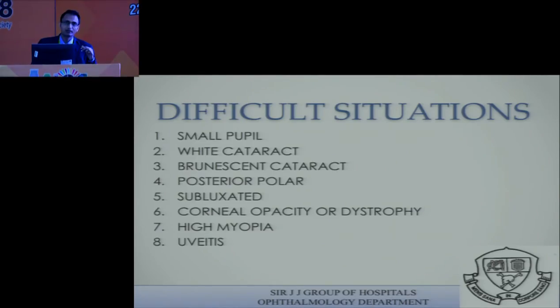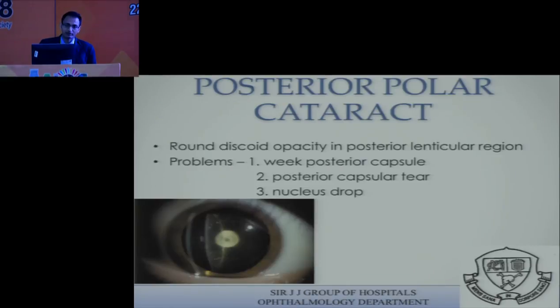Moving ahead, there are multiple difficult situations. Knowing your phaco-dynamics well, you can actually use them in the different kinds of cataract. The small pupil and the hard cataract will be covered by the madam. I will be talking about the soft cataract and the subluxated ones.